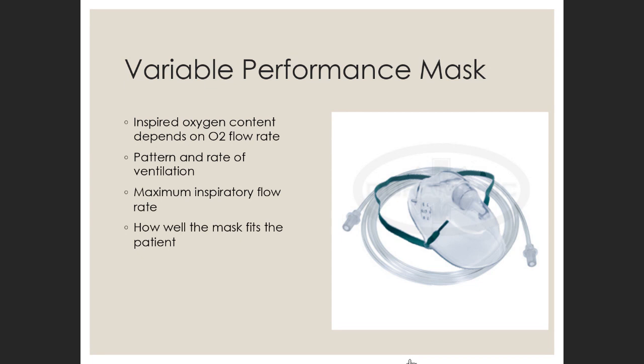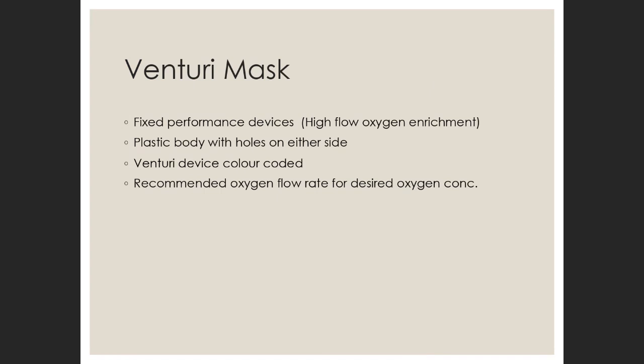Sit the patient up, make sure the mask fits well, decide on an appropriate flow rate, and see what happens. All right? Those are intern jobs.